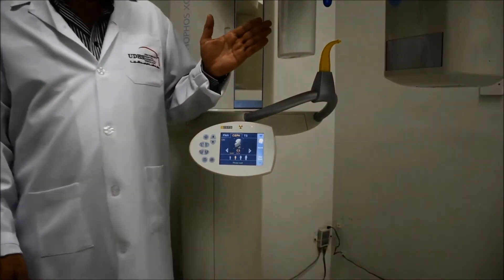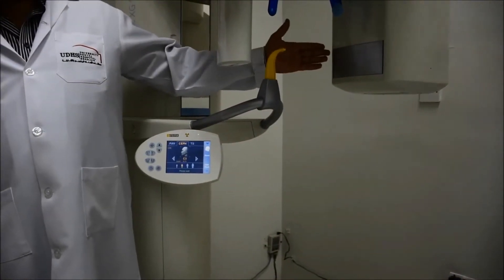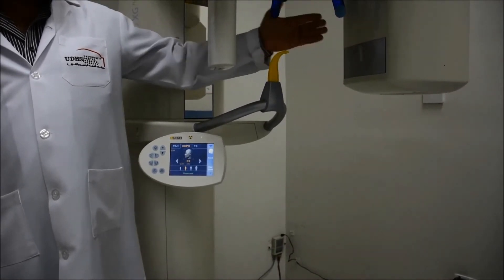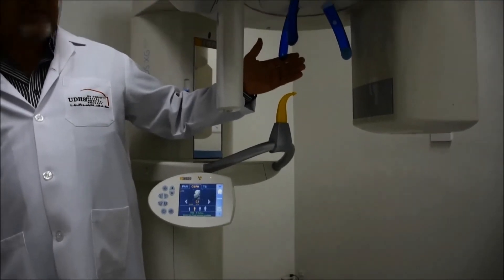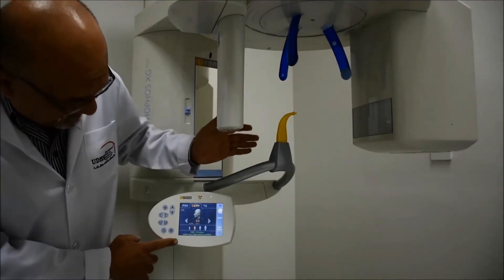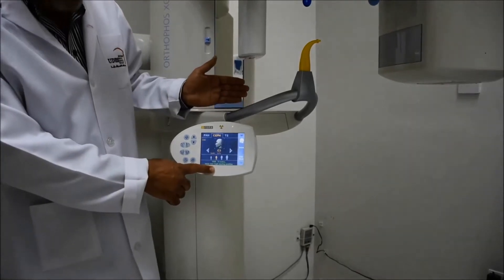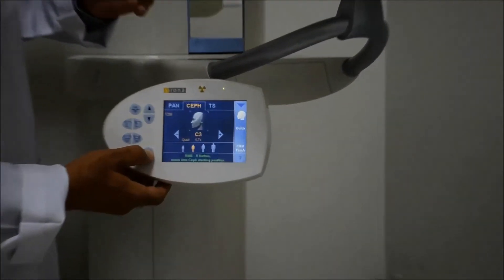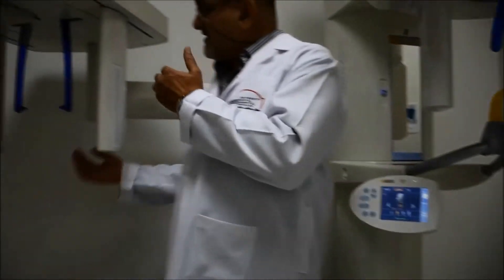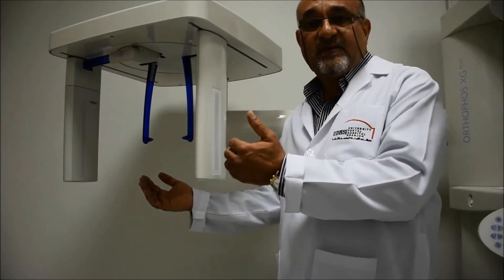The x-ray source will move so that it is perpendicular to the sensor. Then another help message will ask you to move into the ceph starting position. You click reset, and by doing so the lateral ceph moves into the starting position.